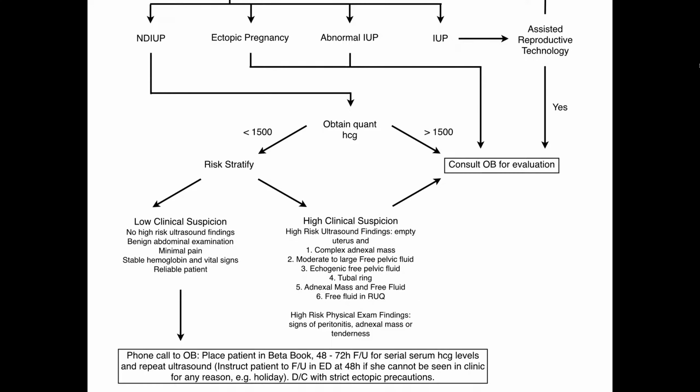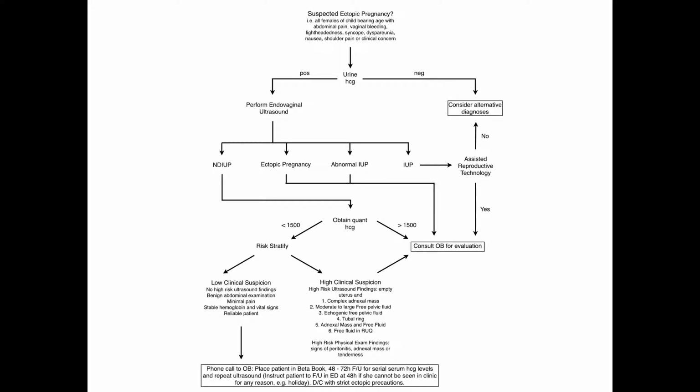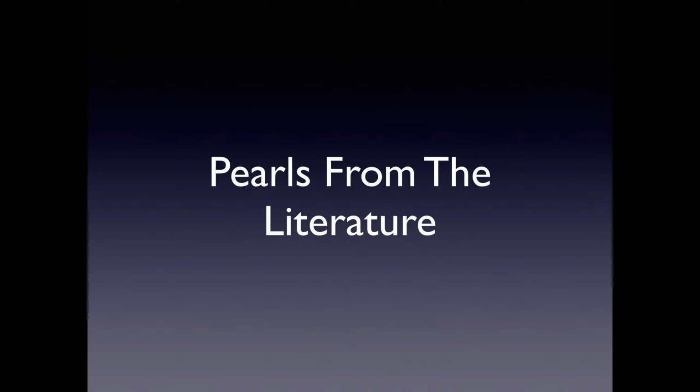So, please follow this protocol for all your patients with suspected ectopic pregnancy to minimize their risk of complication and the risk of missed ectopic pregnancy. Let's review some pearls from the literature.